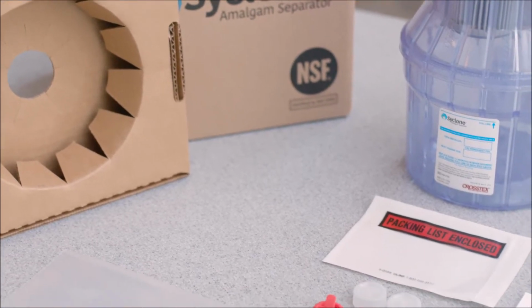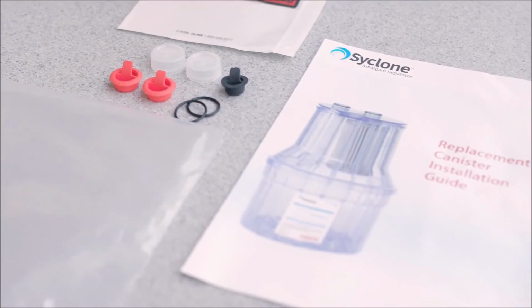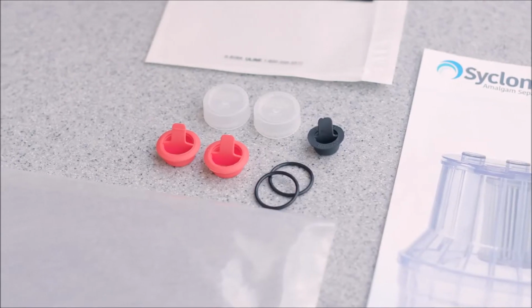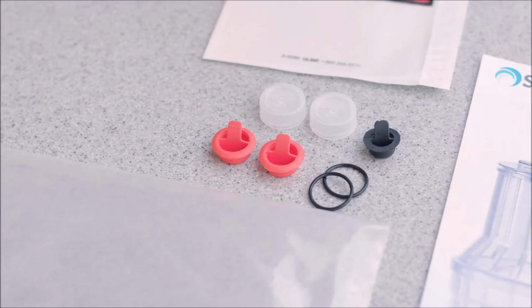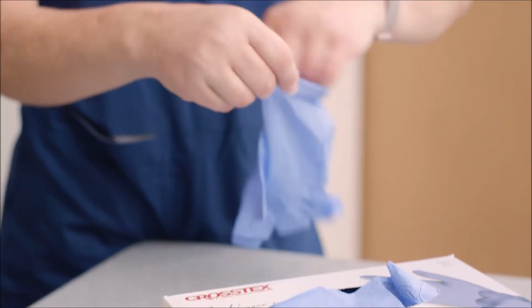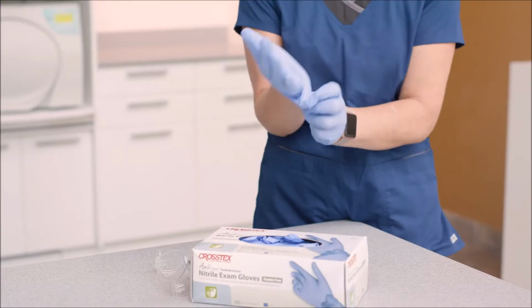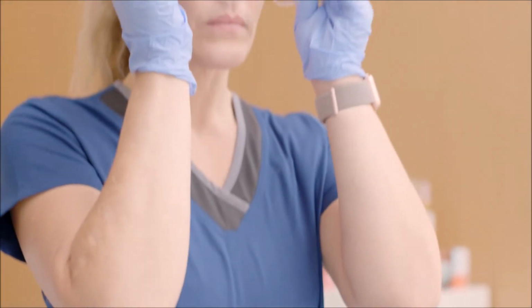Unpack the container and inspect the various components as listed in the replacement canister installation guide. Be sure to remove the caps and plugs from the bag and set them aside for later use. Once all items have been unpacked from the replacement canister kit, ensure that proper PPE is worn before handling the full canister. Gloves and safety glasses or a face shield is recommended.